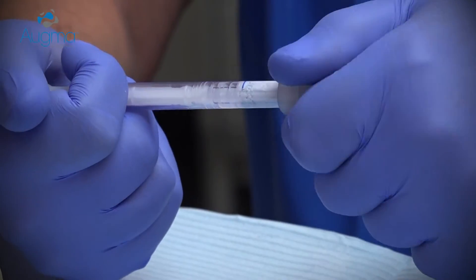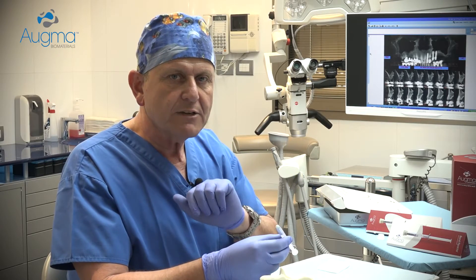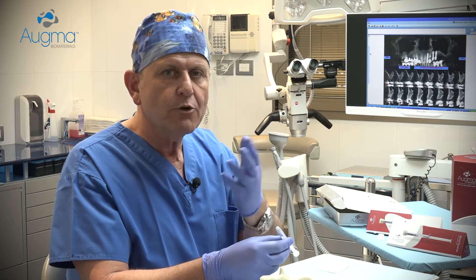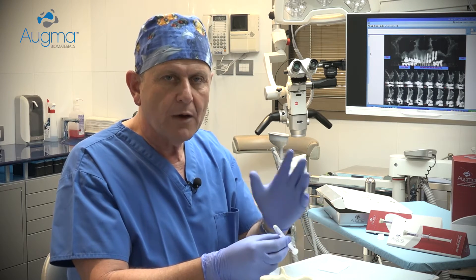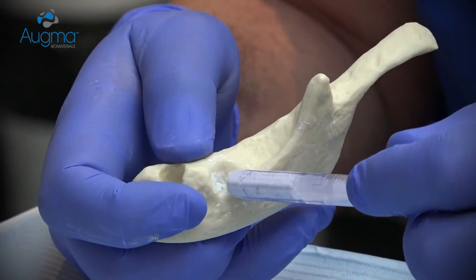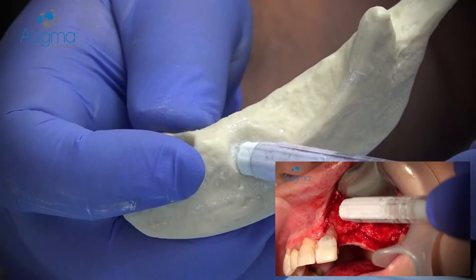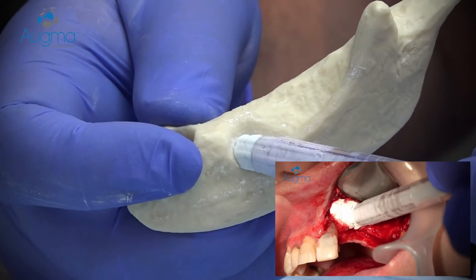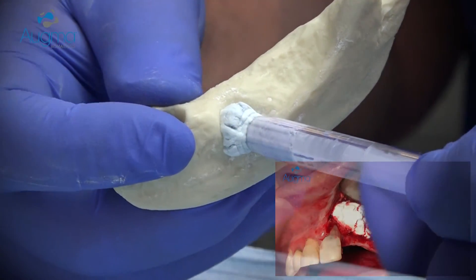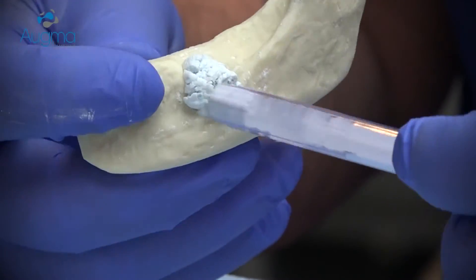Now remove the syringe head. All you need to remember is three simple consecutive steps: place, press, and close — and in less than one minute you can finish the entire procedure. Approach the defect type at a 45-degree angle and start ejecting the material into the grafted site at a 45-degree angle. During the ejection, use the syringe head to help stabilize the material with a small condensing movement.